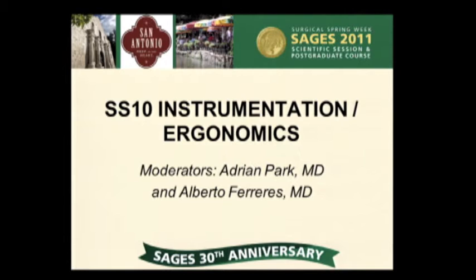Question back. Yoav Mintz from Hadassah, Israel. I enjoyed the presentation. However, in a single incision surgery, one of the form factors is that you have to have a good vision from a 30-degree laparoscope, which is inserted in parallel to your instruments. It wasn't clear from your pictures, did you use an actual laparoscope or did you use the same simulators? Because what I can think is that you didn't have an advantage over articulating instruments because you didn't have to fight with the laparoscope and achieving the right field of view.